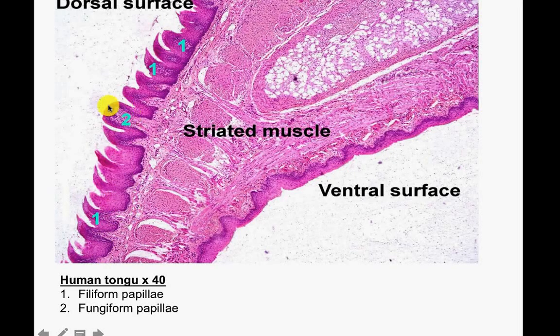while the dorsal surface of the tongue shows the papillae, and we have here the fungiform papillae, which have a broad tip and narrow base, the reverse of the filiform, which is wide base and narrow apex. This is devoid of taste buds. This shows some taste buds. The most numerous is the type 1 filiform papillae, and in between we have some scattered red-colored papillae called fungiform papillae, while those are whitish in color in the living state.